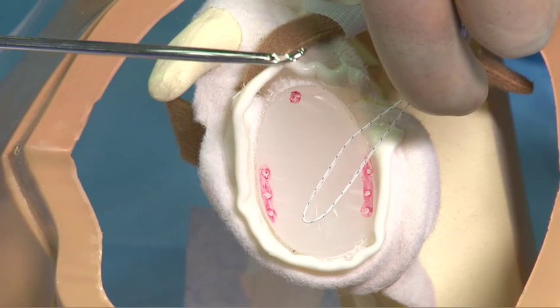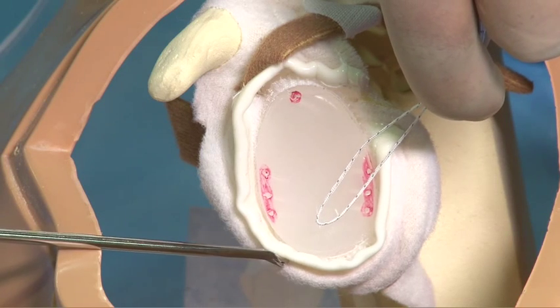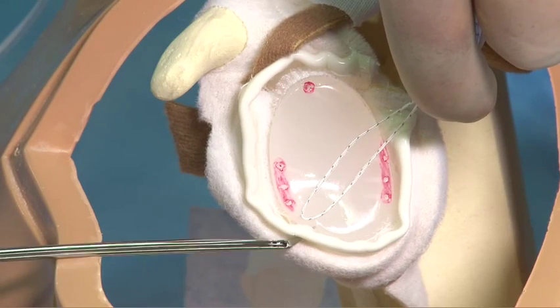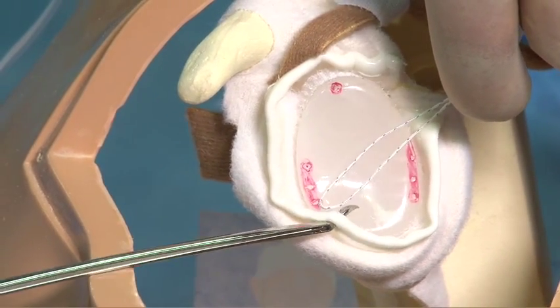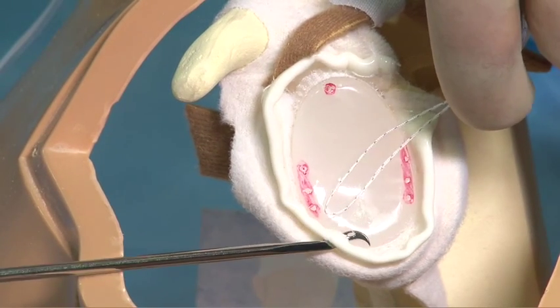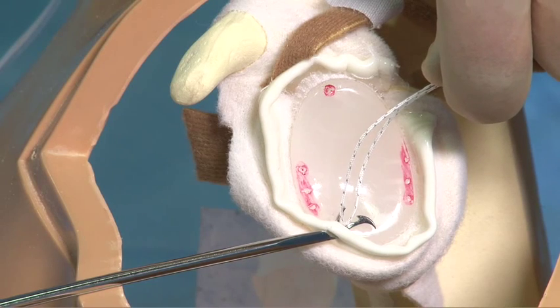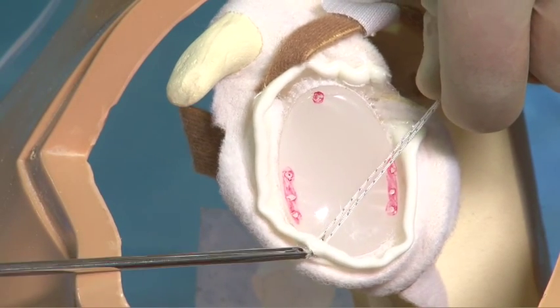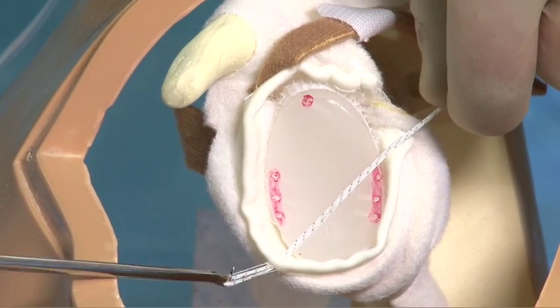With the six-ter, the important understanding is that the device should not be pushed through the tissue but should rather be gently manipulated and twisted through the tissue to create a passage. Once that has happened and the jaw is opened, the suture can be retrieved back through the tissue with the same motion that was used to penetrate the tissue.